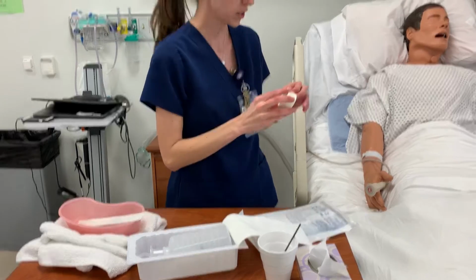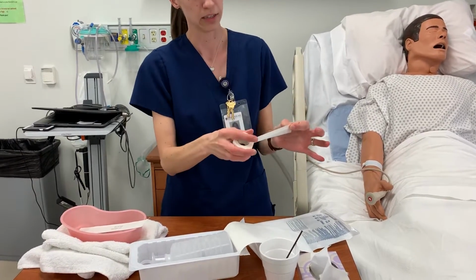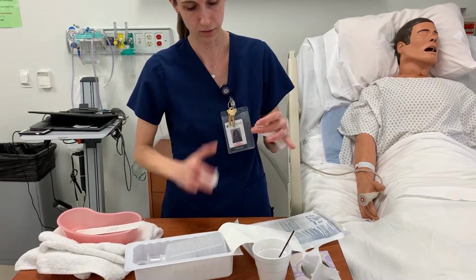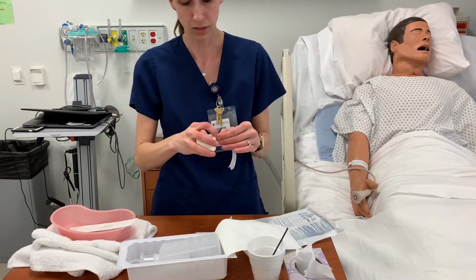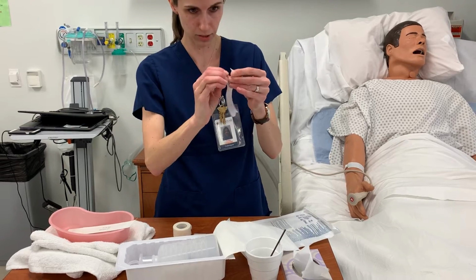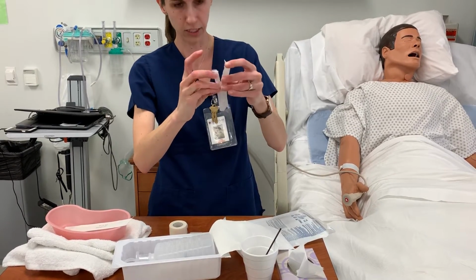What I'm going to be doing right now is just setting up my two pieces of tape that will both be 3 inches long, and one of them I'm going to split halfway down the middle. I'm going to say that's about 3 inches. So I can put one there. And again, this is a clean work surface that I have this on. Another 3 inches. I'm going to try my best to split this down the middle, halfway. Like a little pants.